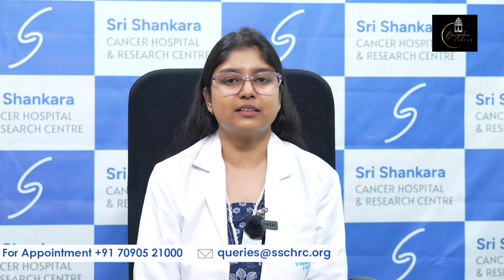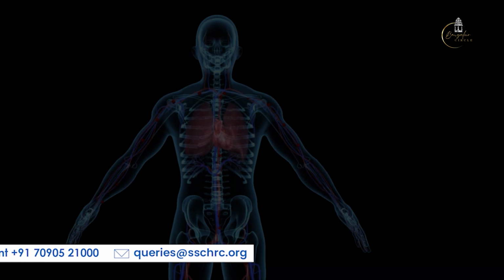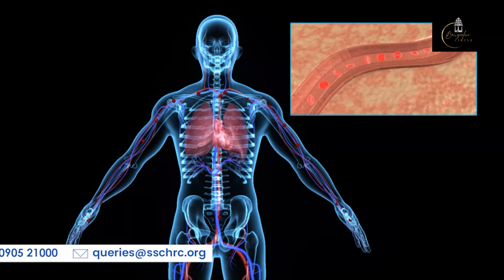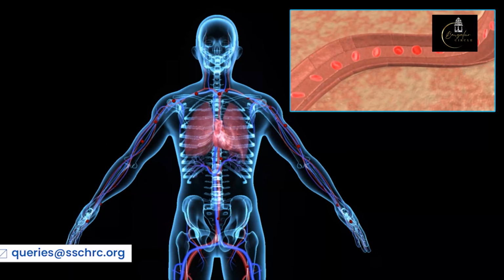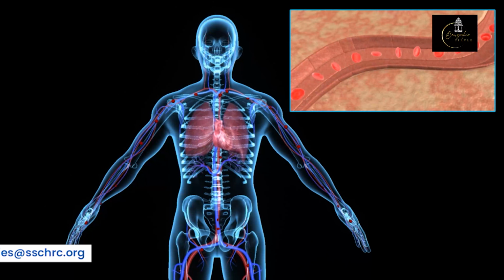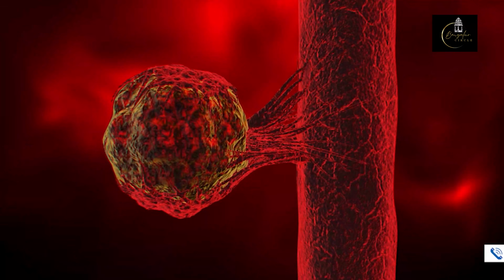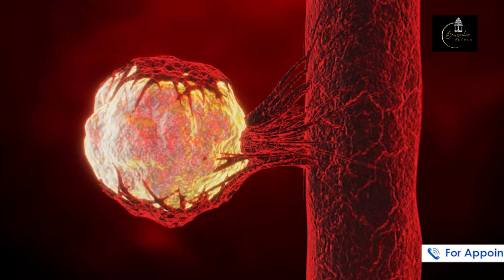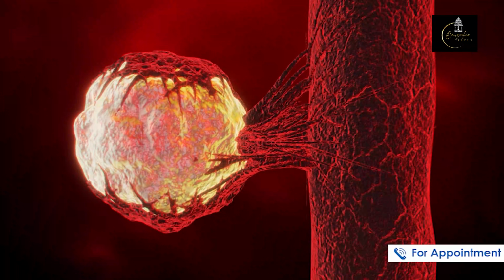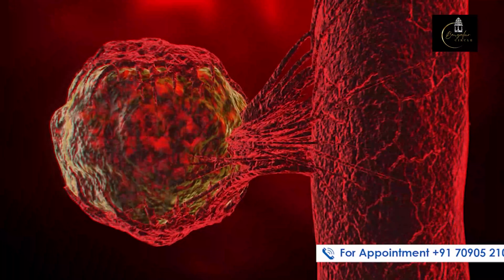After this intravenous injection, this radiotracer, that is FDG, goes all over the body through blood circulation, and once it reaches the cells of the body, every cell which is using glucose will take up this tracer. But cancer cells, being highly metabolically active, have increased metabolism. So these tracers specially go and sit inside those cells, which can then be imaged on our scans.